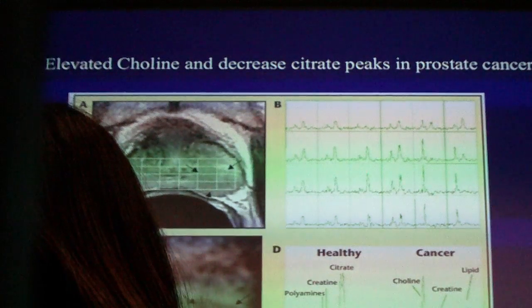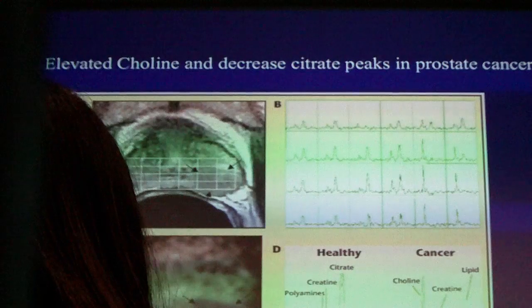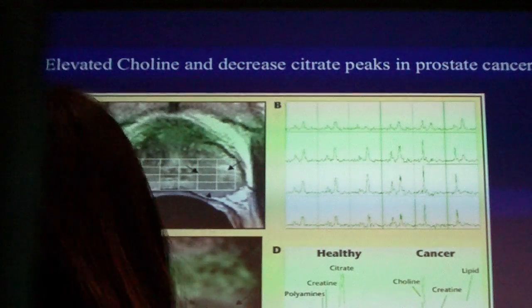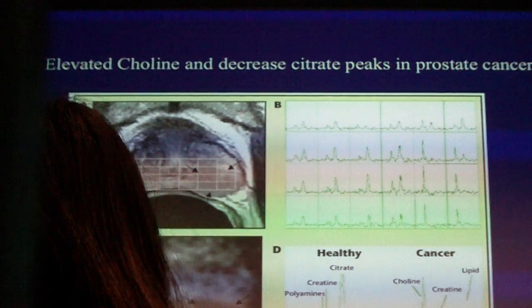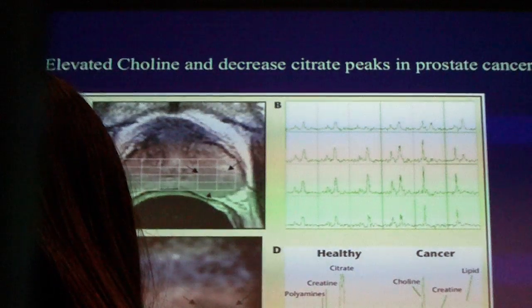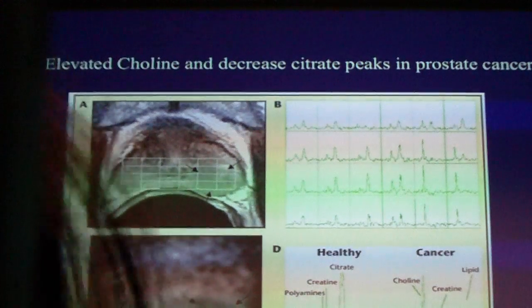In principle, it would also be very valuable to have a sort of cancer staging, because you have different cancers that are more aggressive than others, and what you have to do now is take a biopsy, and this is a tool that could provide the information that you need. The clinical practice is that it's not yet in the clinic. I mean, the potential is there, definitely, but it's not standard clinical practice yet to do spectroscopy, only for certain questions like enzyme deficiencies and for research.